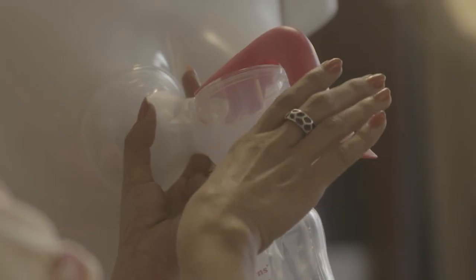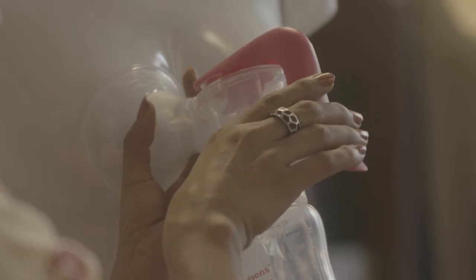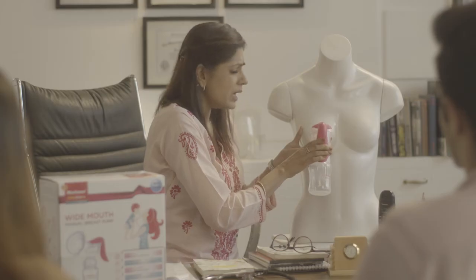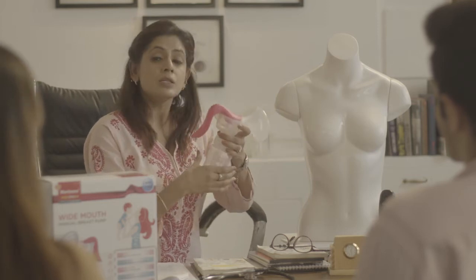Now slowly and gradually press the handle without rushing, in a rhythmic way. It might take a little time, but be patient. When you think you're done and the milk has stopped coming, remove the breast pump and unscrew the bottle.